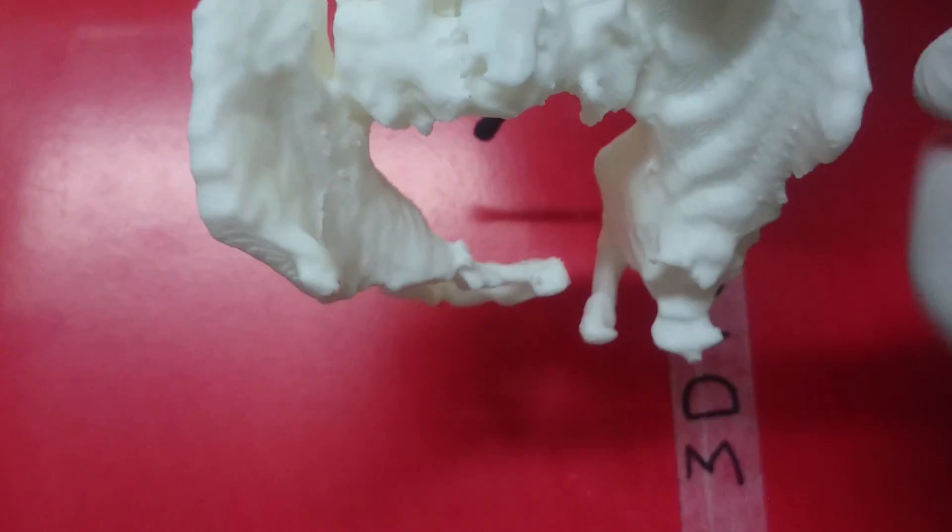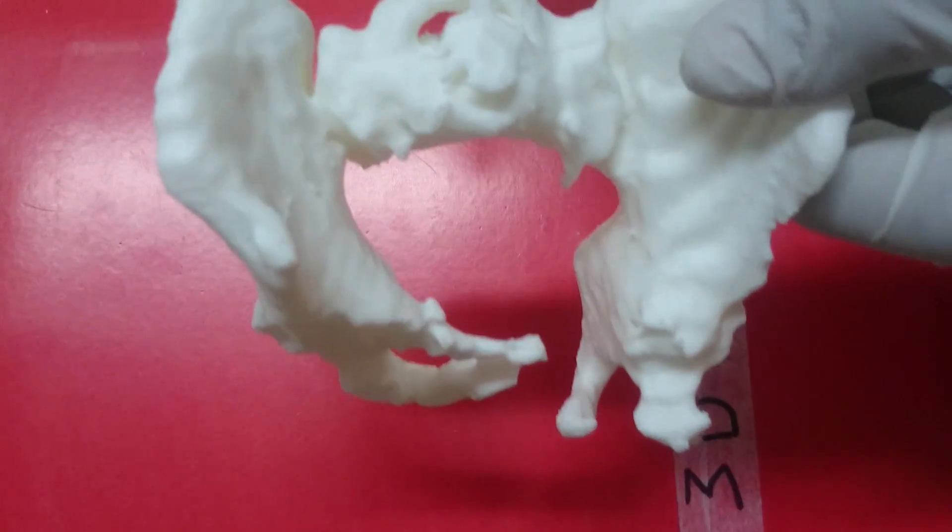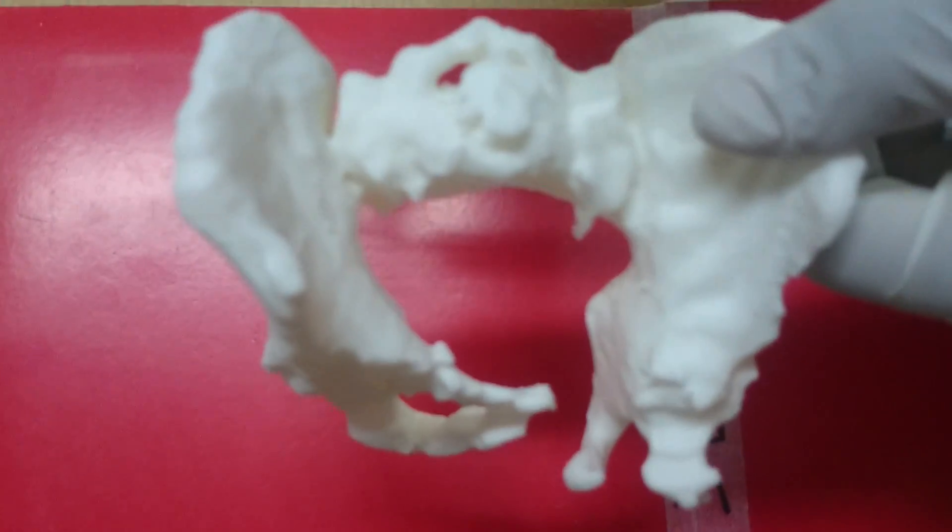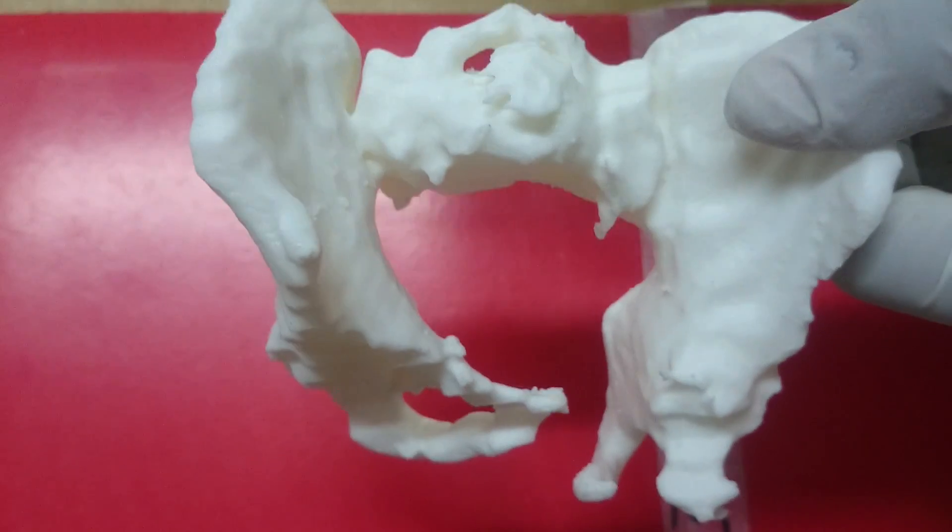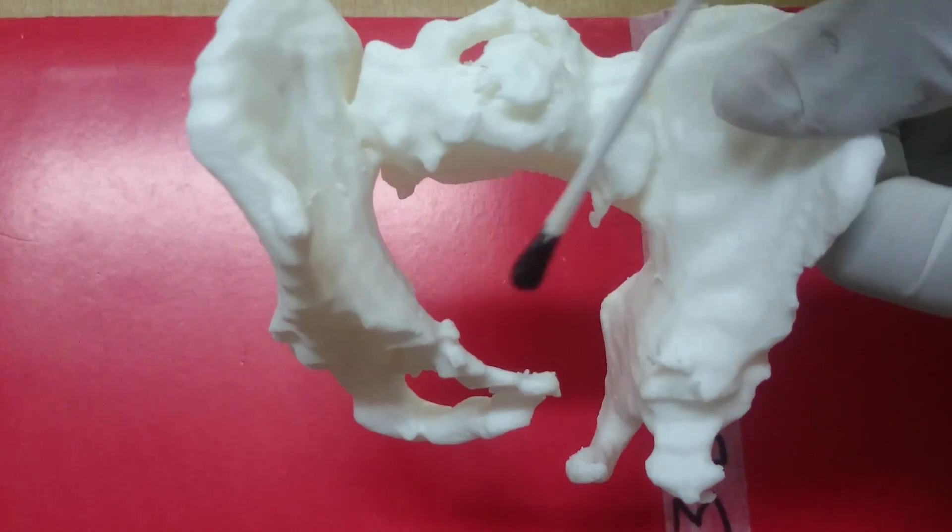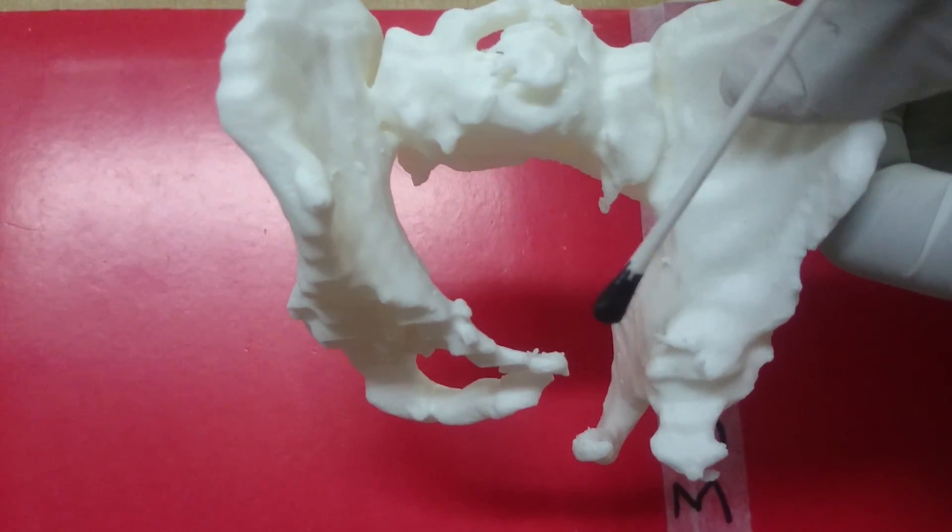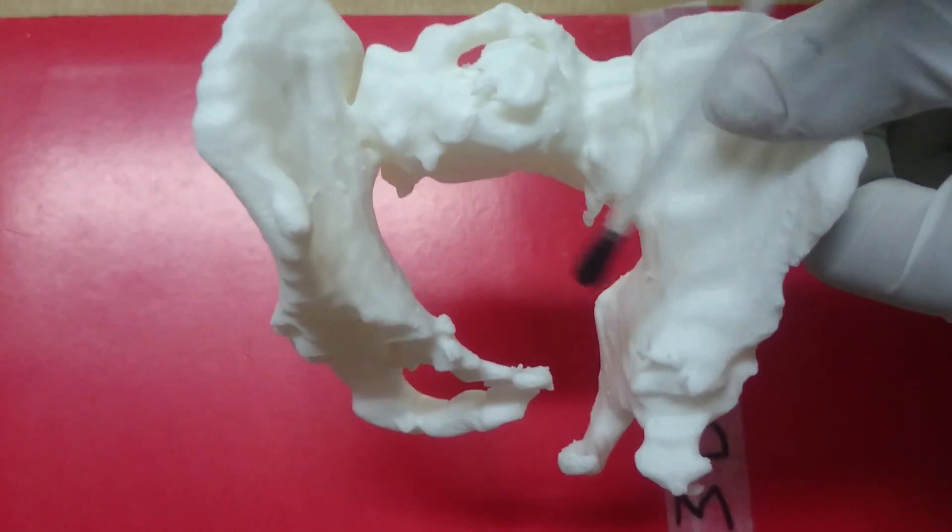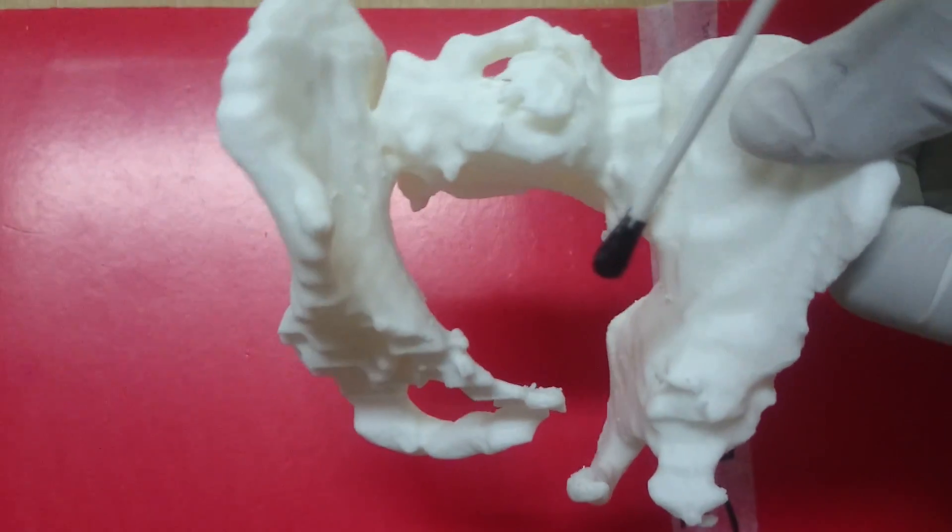The CT scans normally do give us a fair amount of information on what the fracture is like. But having this thing in hand ensures that one can plan his surgery, do a surgical simulation, and also sometimes help detect unknown injuries.